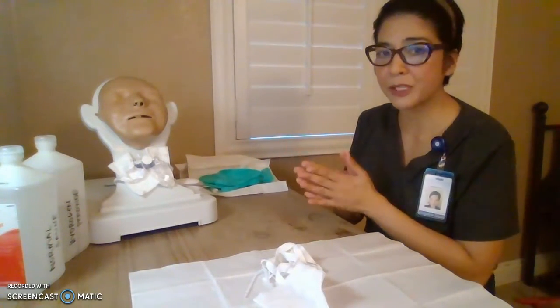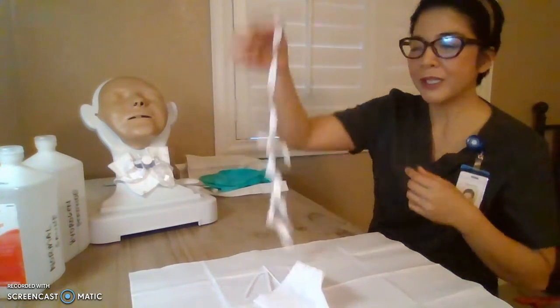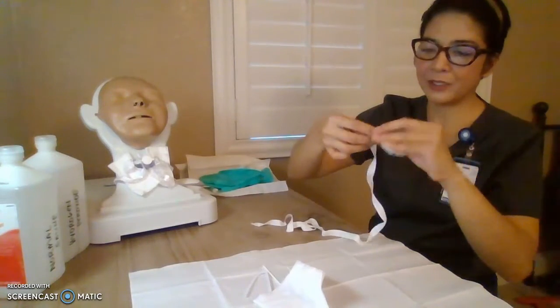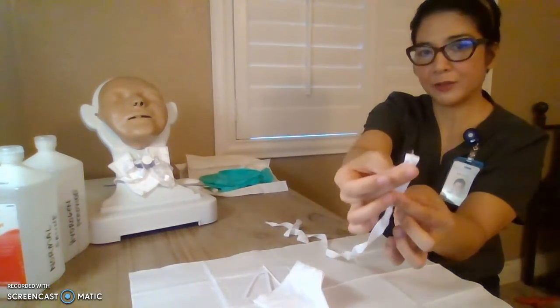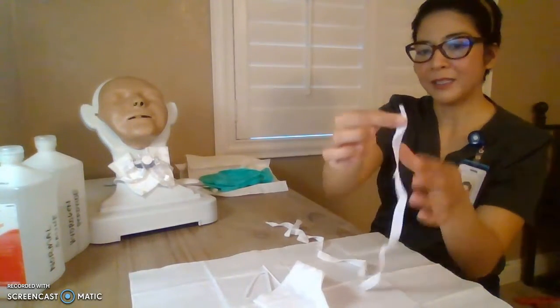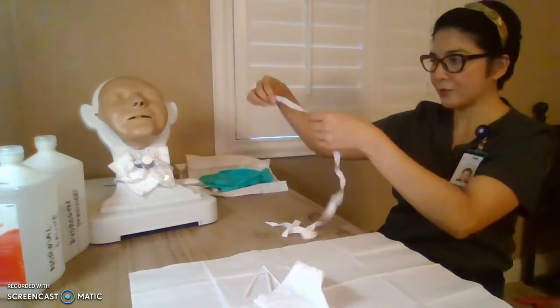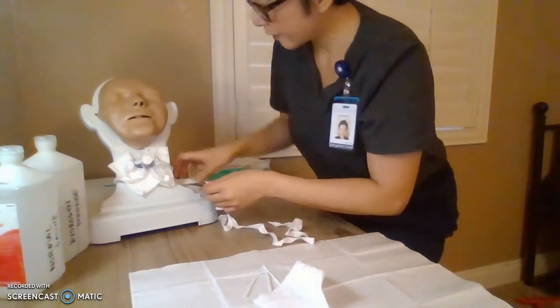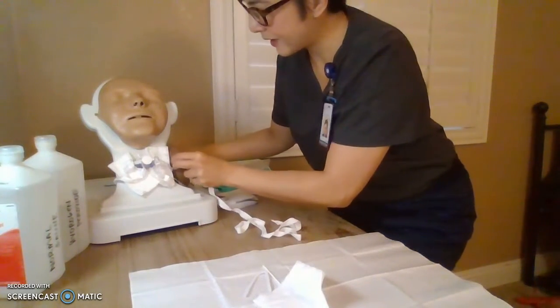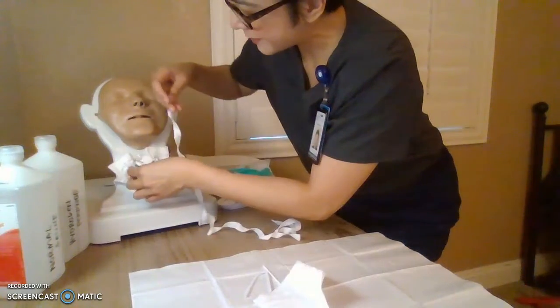So we're going to do it, if you're by yourself, do it one side at a time, okay? So now we have our string right here. What I did, there should be a buttonhole at the end. We're going to insert this end, okay? Just cut it, fold it, and then put a slit, okay? So we're now going to, I'm sorry, this is my patient's skin, supposedly, because my patient doesn't have a neck, so that's his neck.